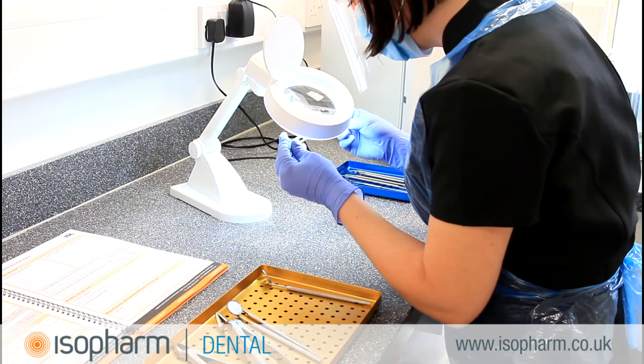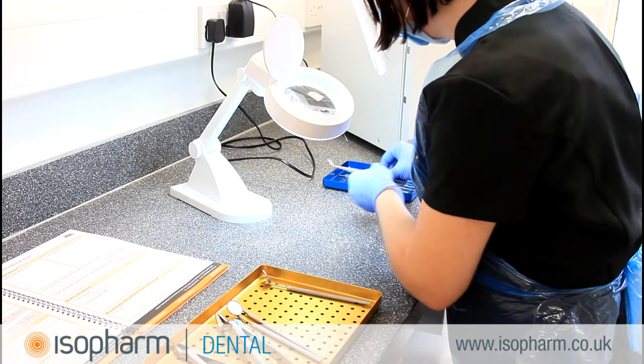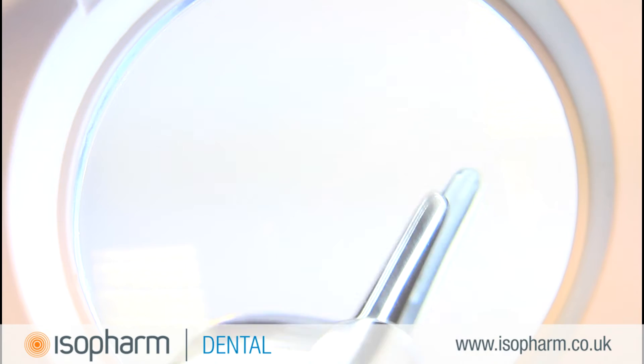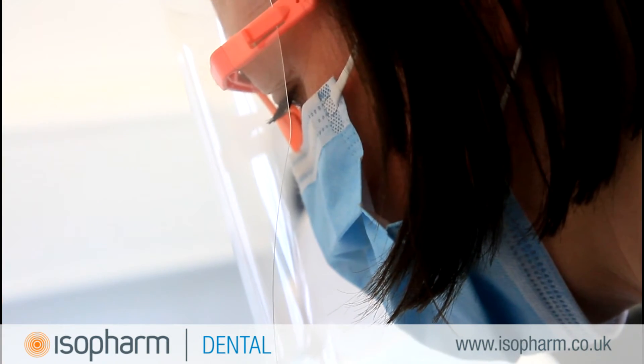When inspecting your instruments you need to pay close attention to areas where debris may build up. Recesses, hinges and corners are places where debris may form. Instruments should be visually clean, have no corrosion, and be checked for signs of damage.